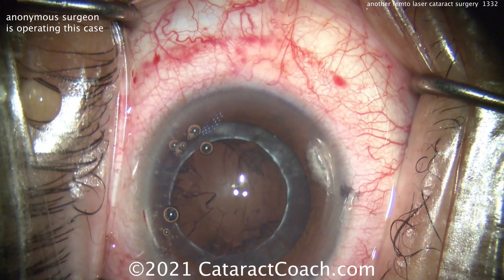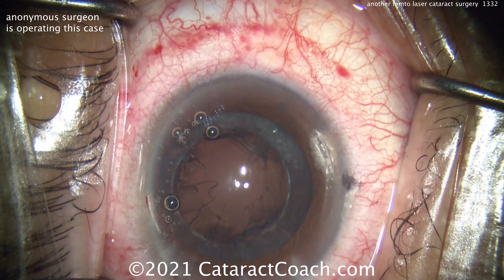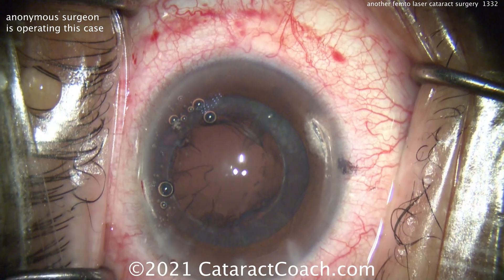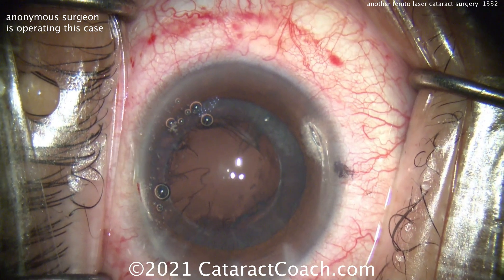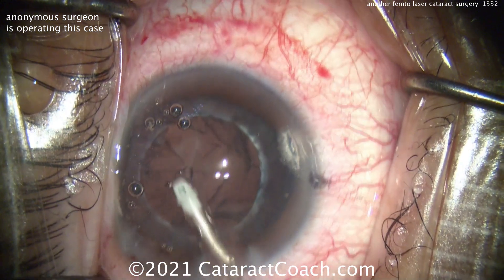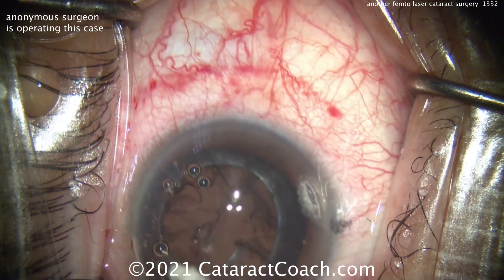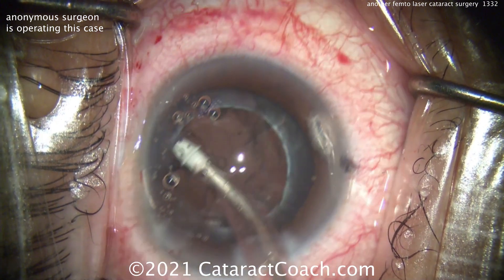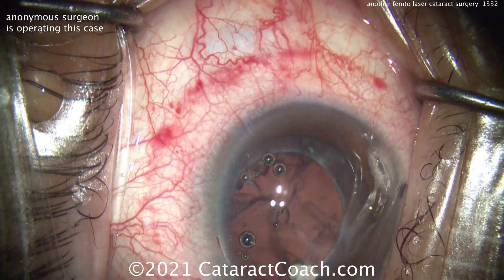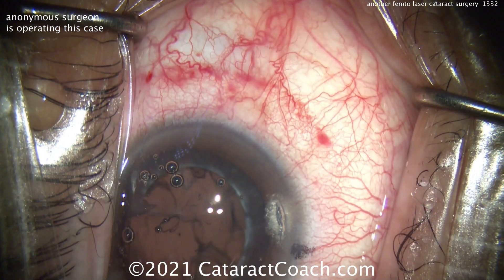I like a femtosecond laser — it's a neat toy. But you just don't need it for the vast majority of your cases. For a routine case, you certainly don't need to use a femtosecond laser, because in a routine case everything's pretty easy. The femtosecond laser for me is better off for just unusual cases — loose zonules, intumescent white cataract, things of this nature. Maybe if it's a tremendously dense cataract, you can use a laser to deliver some energy to help soften up the nucleus. But remember, you still have to put the phaco probe in the eye to remove the cataract. It's not like you're making the surgery any fewer steps — and so the laser doesn't replace the phaco machine as some patients think.